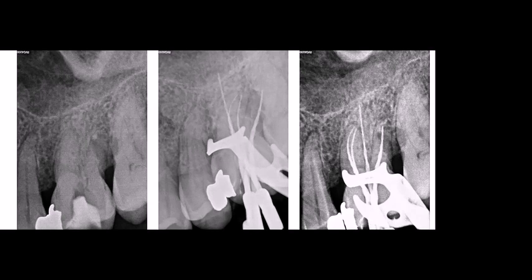So, for example, the MB2 is a very difficult root canal, as we explained earlier. If you use this kind of motor, for example, the WISMI motor, and you press a lot, the file is going to stop in the root canal. You cannot continue with instrumentation. In this way, you are going to avoid the fracture.